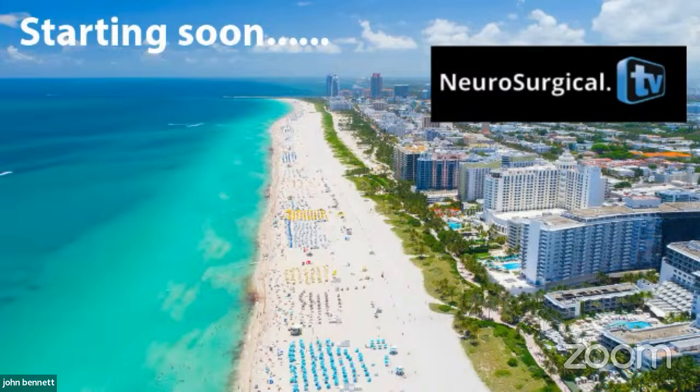So if we did this through a retrosigmoid approach, it's in the deepest part of the corridor, and you would have to either retract or resect this part of the cerebellum to get to this part of the deep AVM. However, if we came at this as the combined petrosal approach, you could see I'm able to come in at a different angle. So this is the combined petrosal approach that I chose.